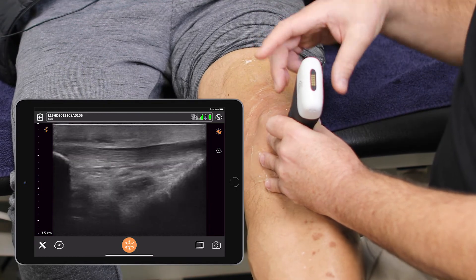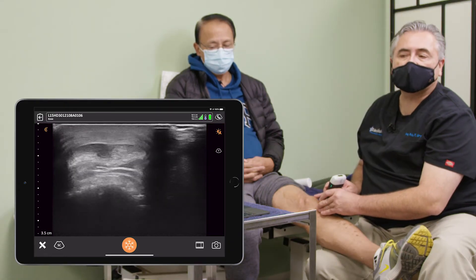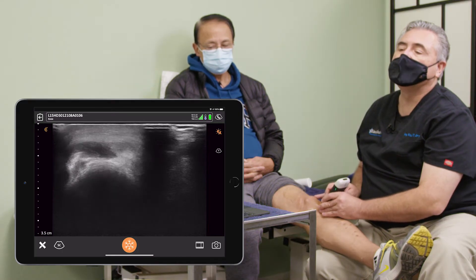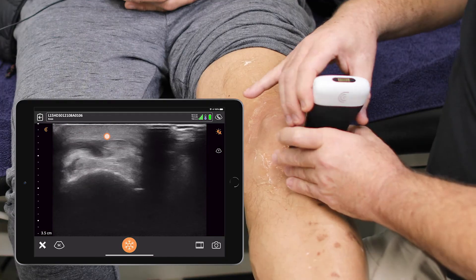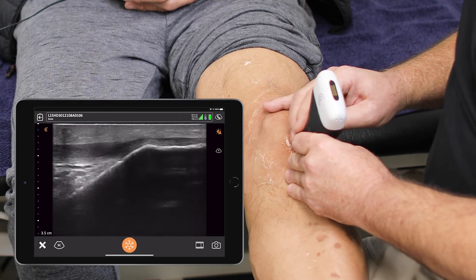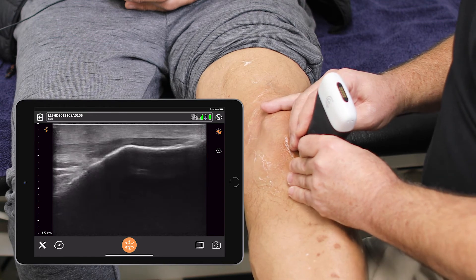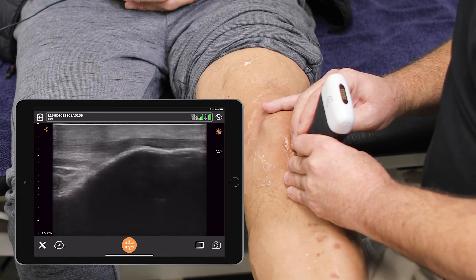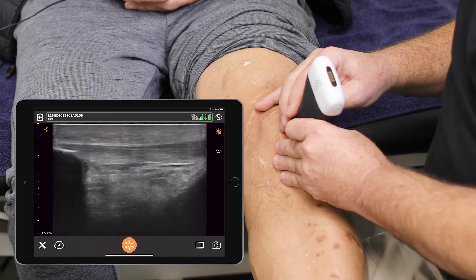I am going to go short axis on that. There is a little evidence on the inferior component of the patellar tendon that there could have been a compromise or a retraction — interfibular compromise. I'm going to verify that on long axis. And again, down on the tibial component, there does appear to have been a partial tear to his patellar tendon at some point, but there is no evidence of reactive effusion here.